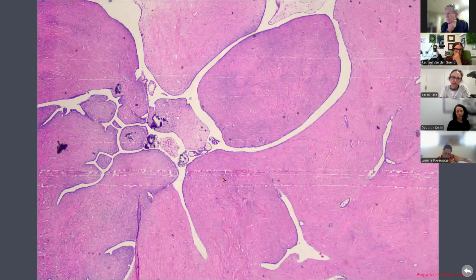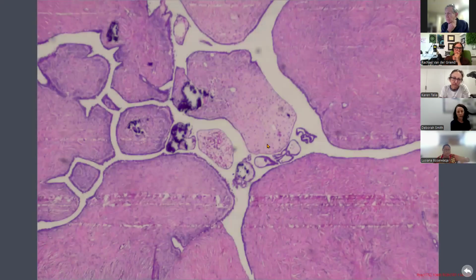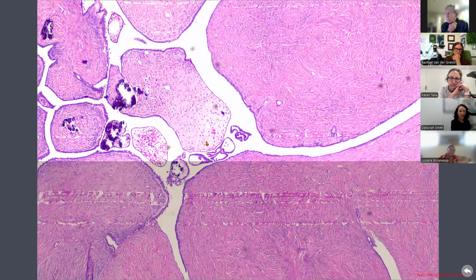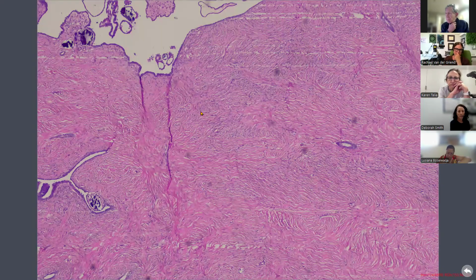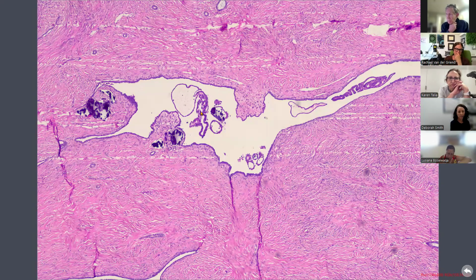And then you just get these little tufts of proliferative epithelium sitting in the background. Psammomatous calcification there. Is this enough? What does 10% mean? Can we give it 10% when you've got so much? For me, it starts to get up into the category of, I'm definitely going to look at this carefully. It's more than just a tiny bit.